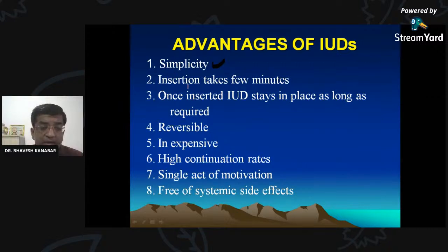The second thing is insertion takes only a few minutes. So it is an OPD procedure, I already said. Once inserted, the IUD stays in place as long as it is required. For the majority of devices, it is variable, 2 years, 5 years. So it can stay as long as it is required. And the woman does not have to take an everyday pill. In contraceptive pills, the woman has to take it every day. Once the IUD is inserted, the contraception is for a longer duration.